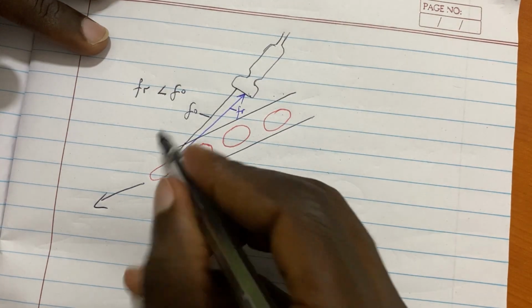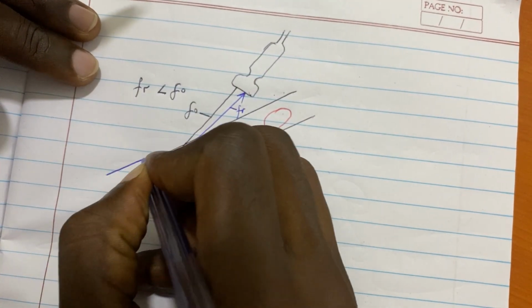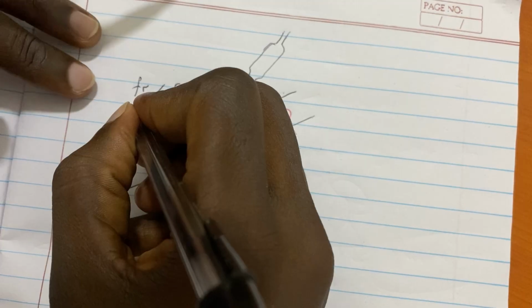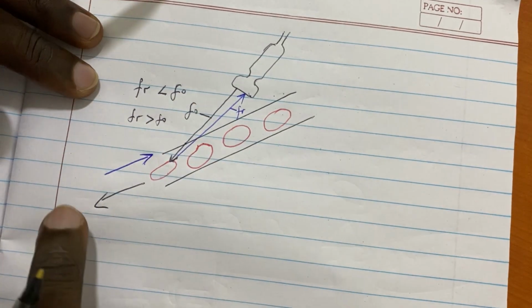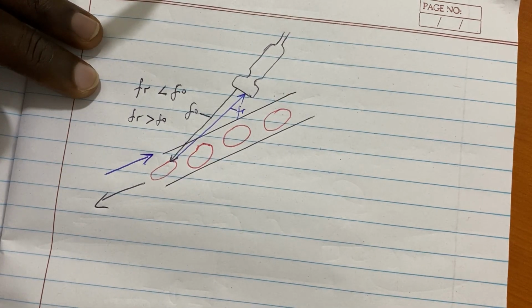And if we change that, if this red blood cell were coming towards the probe, then FR will be greater than F naught. So that is the Doppler shift, but it's not as easy as that.